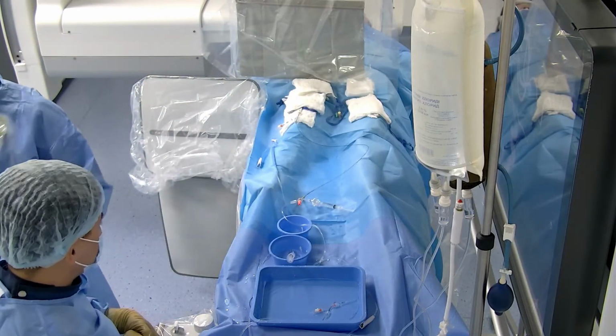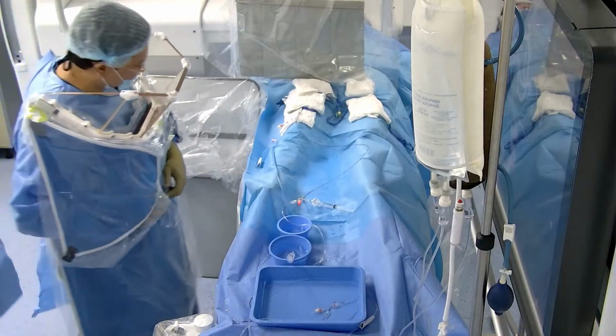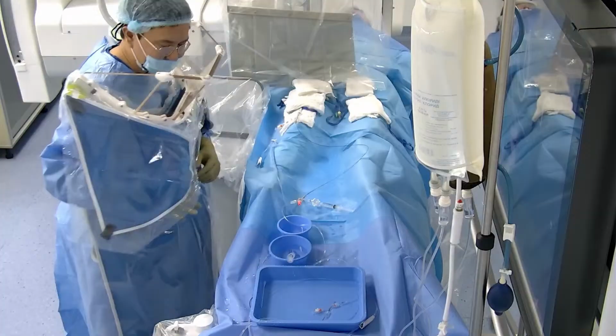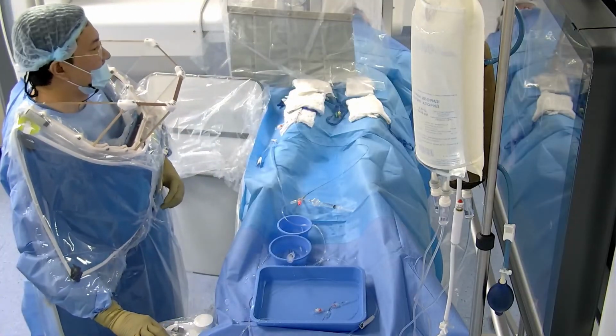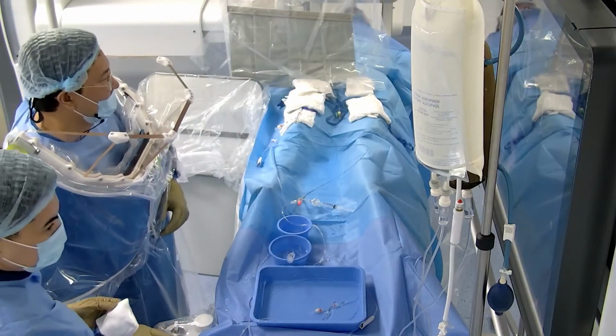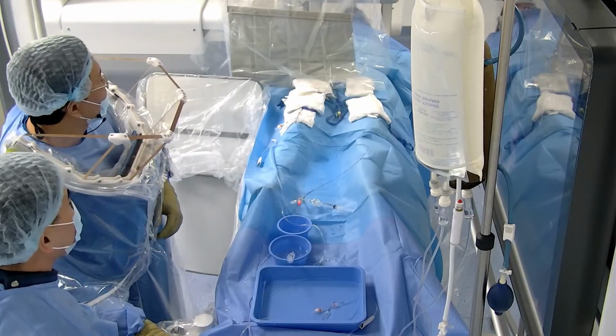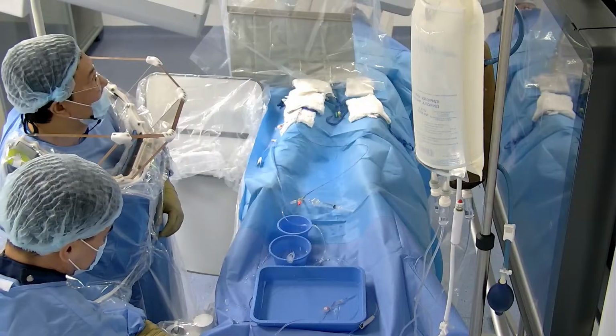Okay. The preparation of the Eclipse double lumen balloon is similar. It's prepared in a similar way. Okay, 37 left will be the working projection.